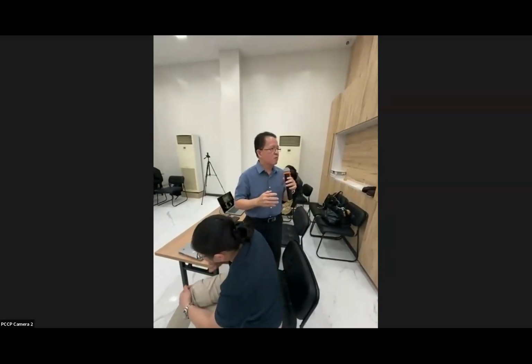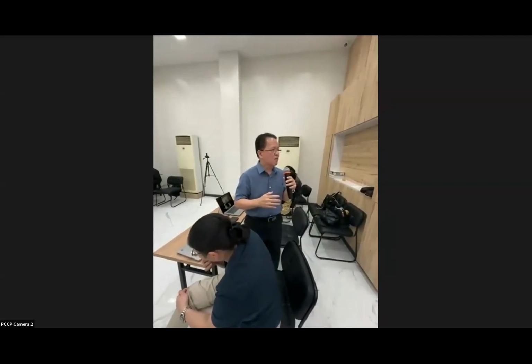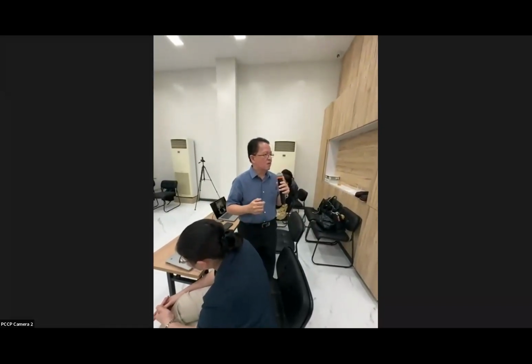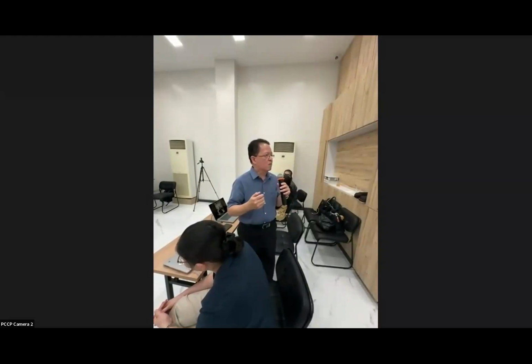And in terms of perioperative examination of patients, this is a very useful tool, especially for those with borderline numbers in your initial evaluation. There are a number of other uses of CPET. You can use this for disability. You can use this for rehab and for other purposes that it may serve.